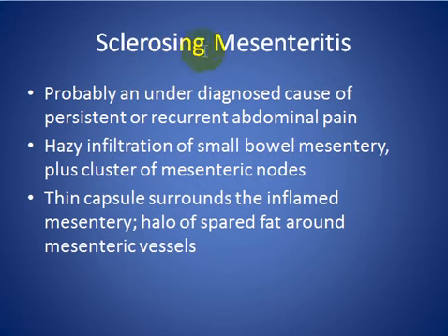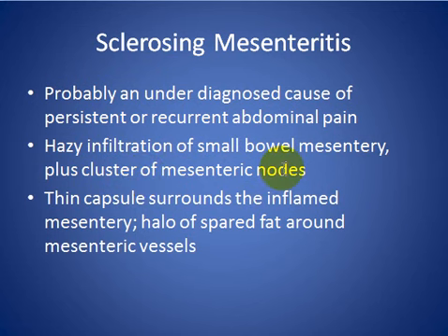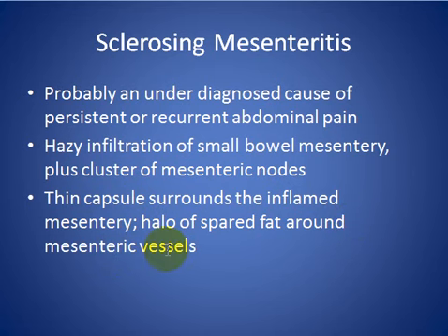Sclerosing mesenteritis is probably an underdiagnosed cause of persistent or recurrent abdominal pain. There is hazy infiltration of the small bowel mesentery with a cluster of mesenteric lymph nodes. A thin capsule surrounds the inflamed mesentery, associated with a halo of spared fat around mesenteric vessels.